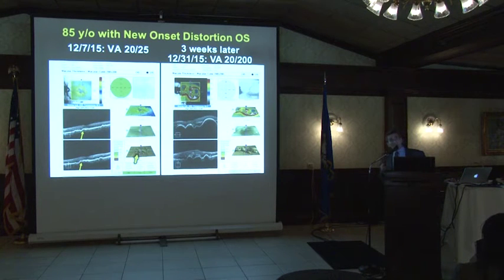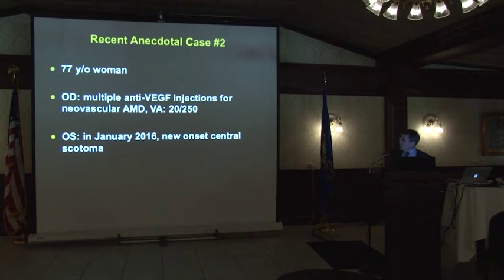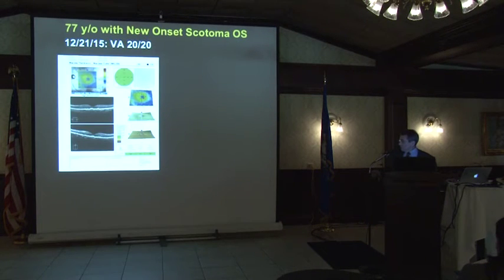Do you think this blood vessel just popped up suddenly and grew like that and started exuding in a period of 3 weeks? I don't think so. I think the culprit is right there, but we just don't see it yet. How about another patient, a 77-year-old, multiple injections in the right eye, left eye. In January, came in, boom, vision was worse. This is what the patient looked like.